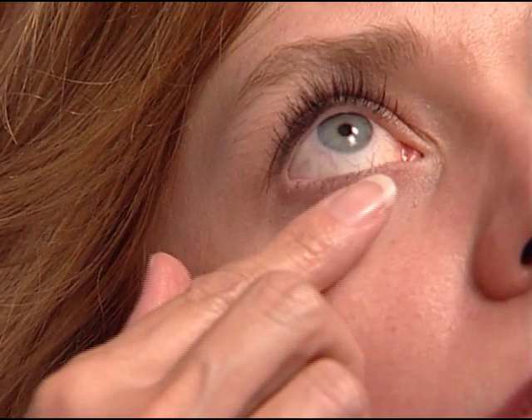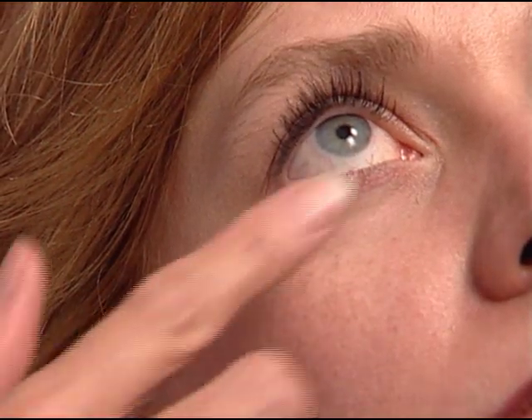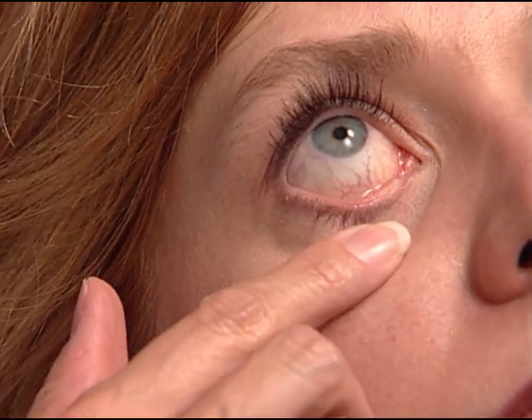After insertion, carefully inspect the punctal area to confirm the parasol plug has been properly placed.